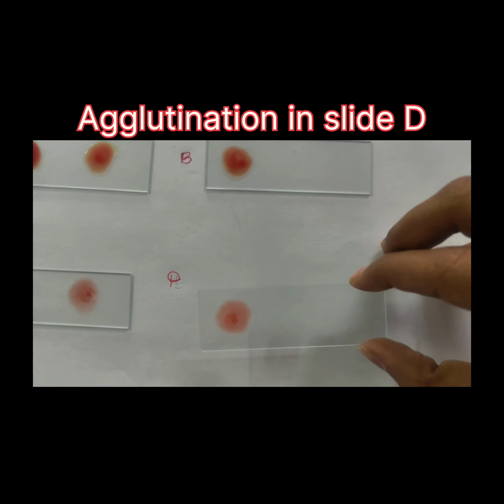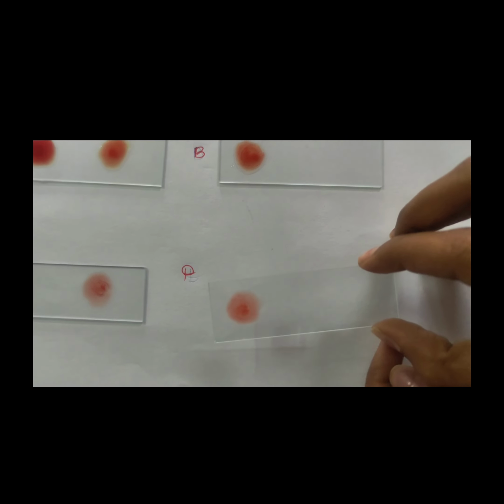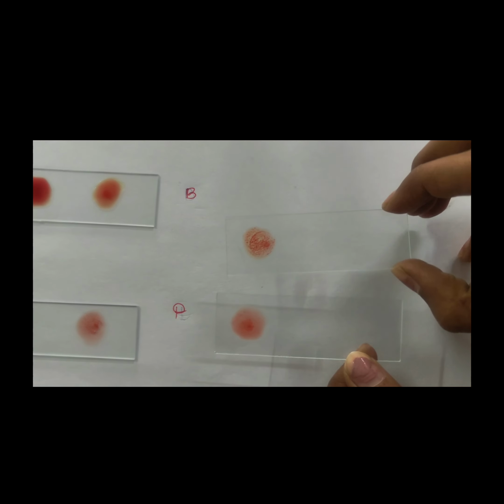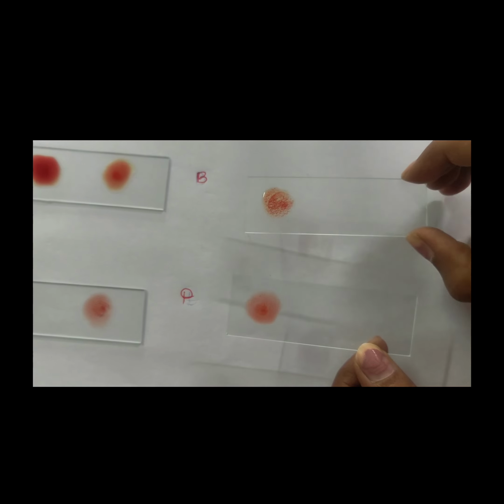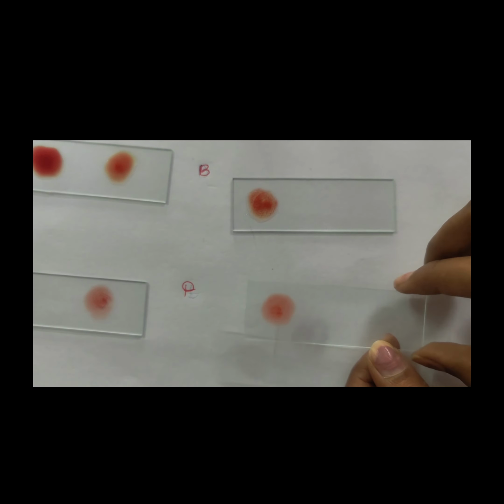Slide D also shows the clumping and agglutination of RBCs. So, in the second sample, slide B and slide D show clumping of RBC. The blood group is B positive.